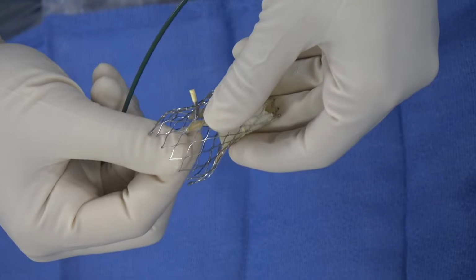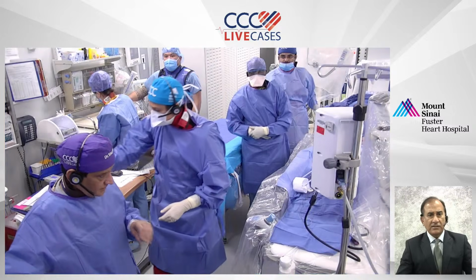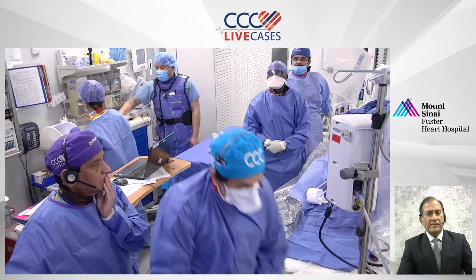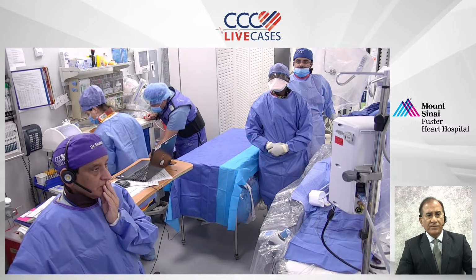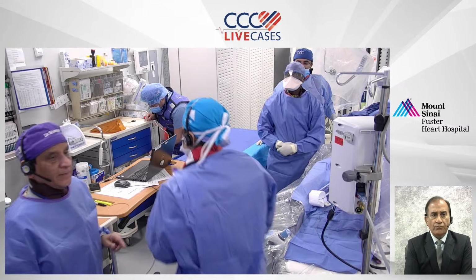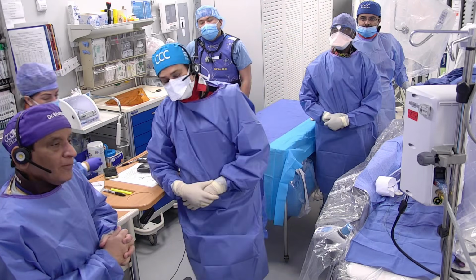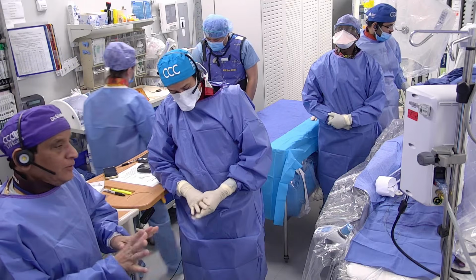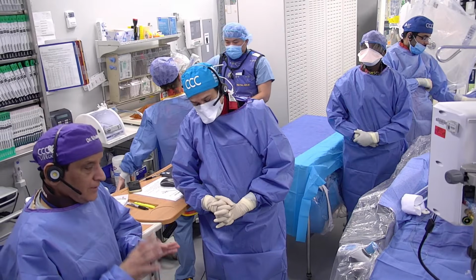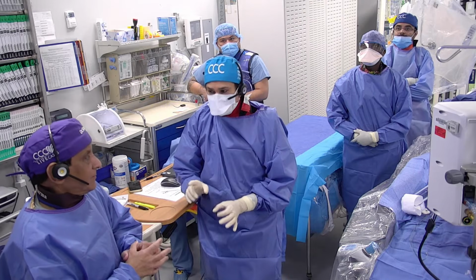Excellent demonstration, Samin. 2 quick follow-up questions, and then there is a larger issue which Dr. Jha has raised. First of all, this is a question from Dr. Rice: can you put an Impella through one of these TAVR valves? Yes. They actually have done it, but the recommendation is do not do it because there has been some damage to the valve. So you try to avoid it. But carefully, in a rare case, if you need to, you do. Otherwise, do a balloon pump. The recommendation is to avoid putting an Impella through the TAVR valve because there have been reports of distorting the valve. Impella is a big one, so that will distort the valve frame, not the leaflets.